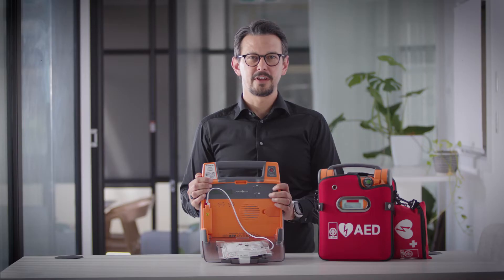Even when the battery is low, the unit is still capable of delivering nine shocks — more than enough to save a life.